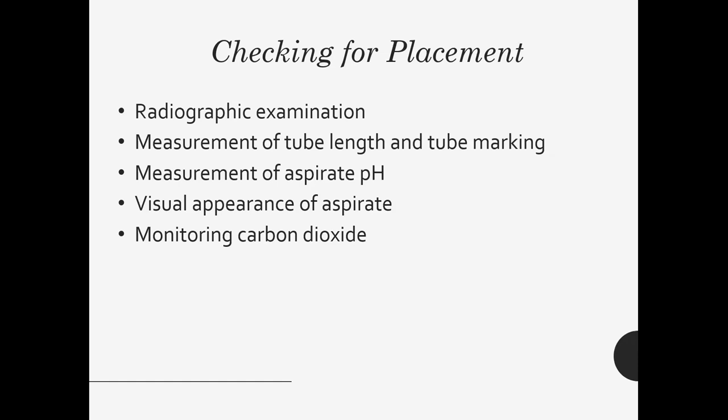Then after that, every other time, we're going to check in a different way. So we're not going to get an x-ray every single time. There's no need to do that and expose the patient to more radiation than necessary. So after the initial time, usually the physician, the doctor, will look at it after the radiologist has read it and give an okay to use order for the NG tube.